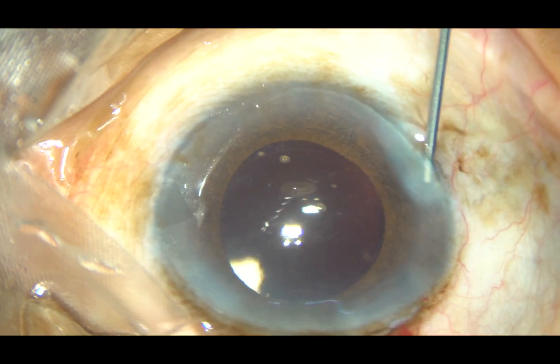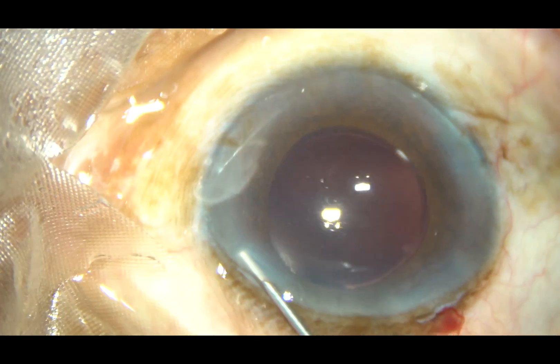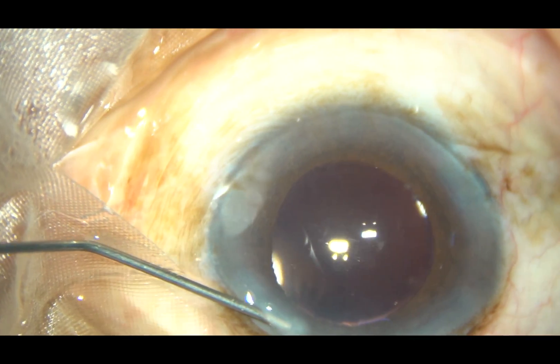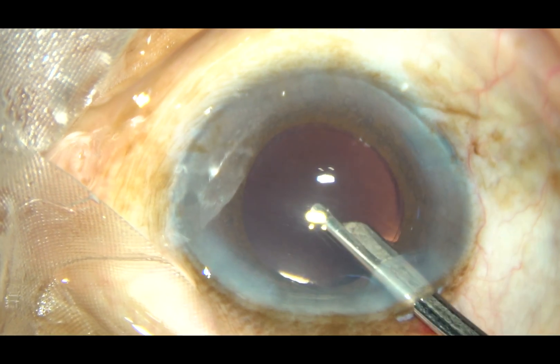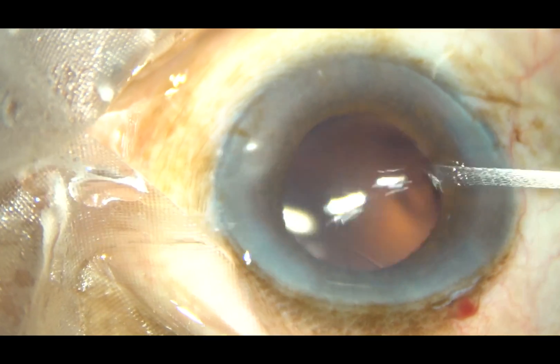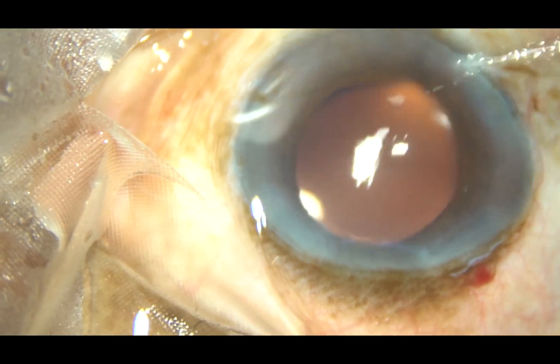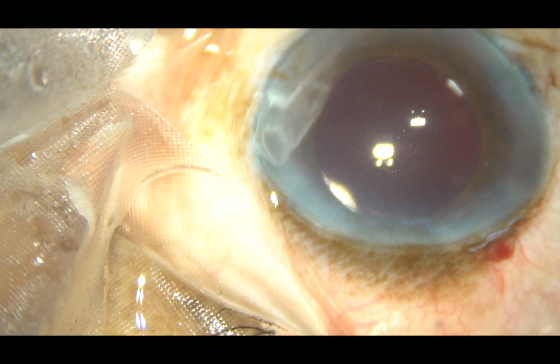And now, these side ports are hydrated nicely so that these stromal wounds close and become self-sealing. And then, a final lavage of the anterior chamber is done. Injecting moxifloxacin is your choice, but I injected it a little earlier, not as the last step. The last step is a final BSS lavage.